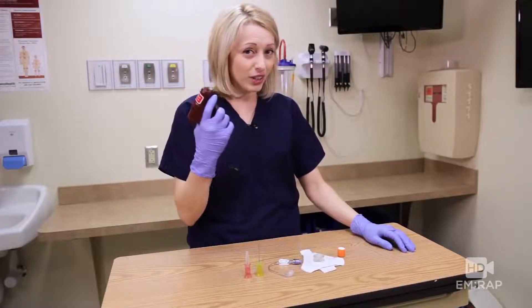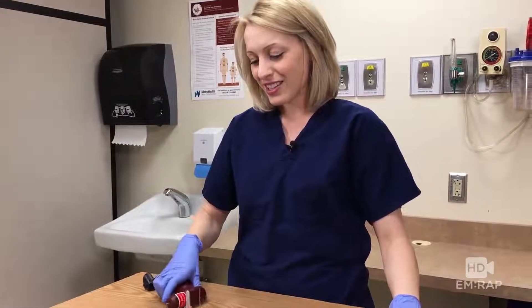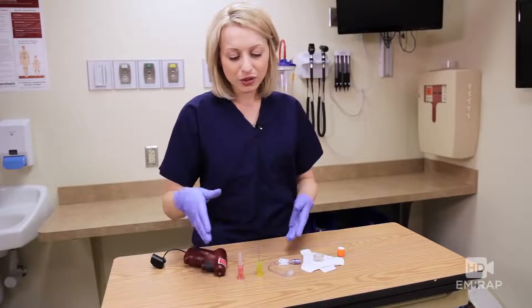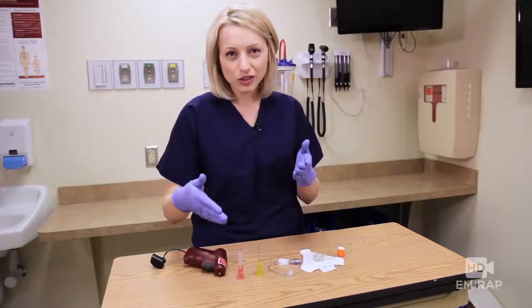It comes with a drill. It comes with three needles — we've only got two today because we're on a budget. There's pink for pediatric, because all kids like pink. Blue, which is not shown, fits in most adult sites.